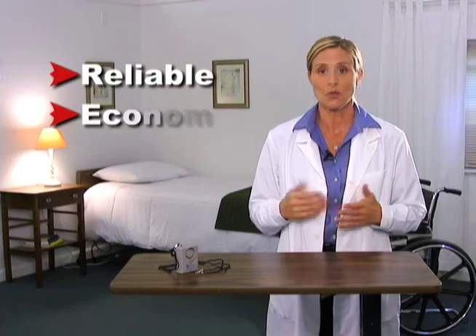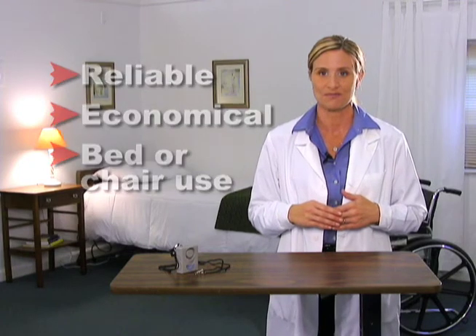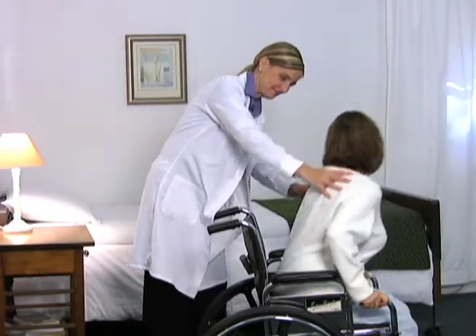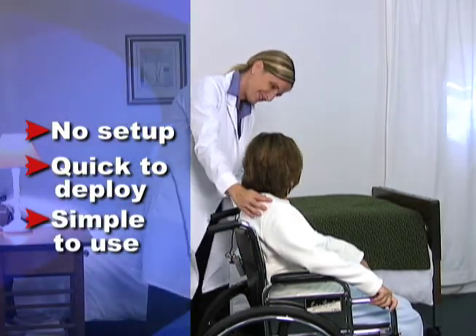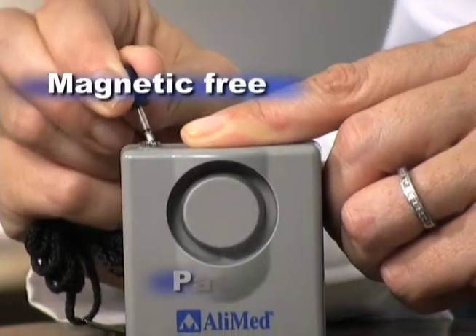You said you wanted a reliable and economical alarm with the ability to monitor a patient who is either seated or lying down. The pull cord basic alarm is a staff alert device used to signal when a patient is at risk of falling when they attempt to rise. It requires practically no setup, so it's quick to deploy and simple to use. It is intended for basic use and is magnet free, so it won't interfere with electronic equipment, including pacemakers.